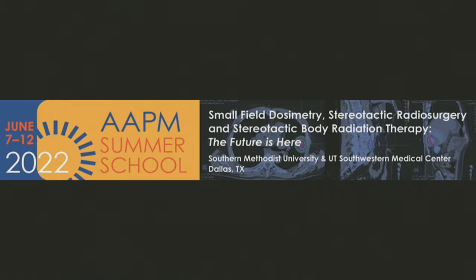Yeah, it's interesting. I think if it's completely automated, hopefully there's not variability, but if there is anything done manually at the step, like let's say the initial rigid registration, for example, or locking points, right? Then yes, there will be. But good question. I haven't heard of anyone looking at that. I don't know if anyone has.